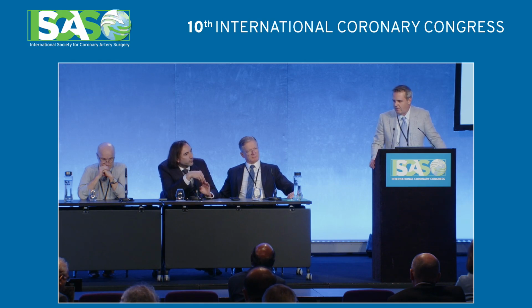Yeah, I think it's a fair question, because in the CTO world we don't have that answer. Okay, so we have 2-year data, and 2-year data would say that it's somewhere around a 3 to 4% TVR failure rate. So I think the question comes up with the DAPT therapy and things like that, in those situations.